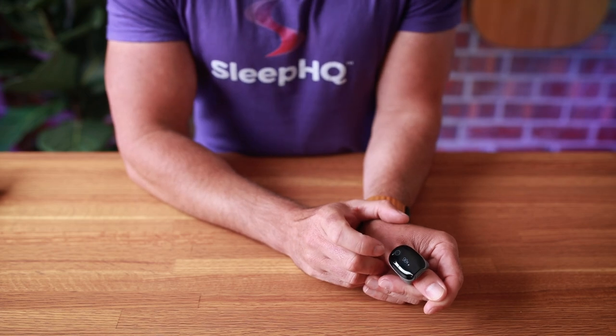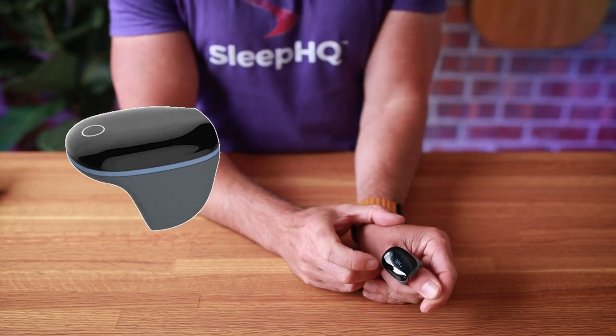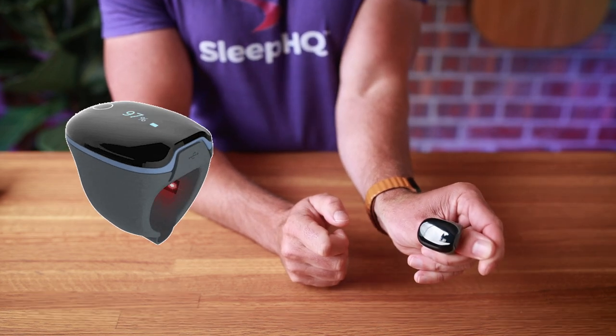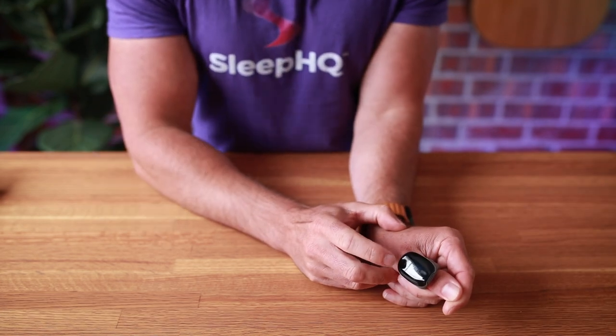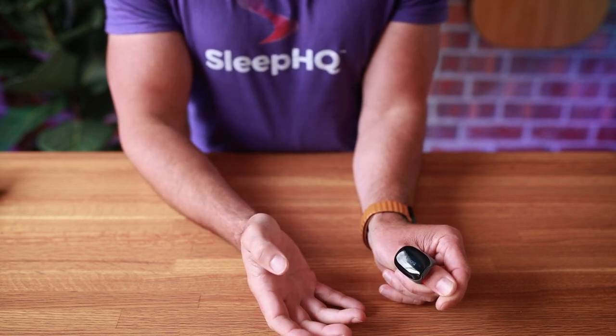On top of the ring we have an OLED screen that cycles through the blood oxygen levels and heart rate, so you can instantly see exactly what's going on. We also have a little button you can tap which will show you the time and the battery level on the ring.